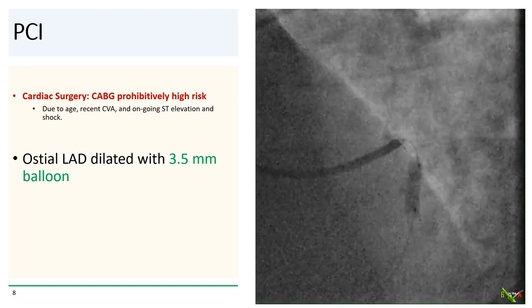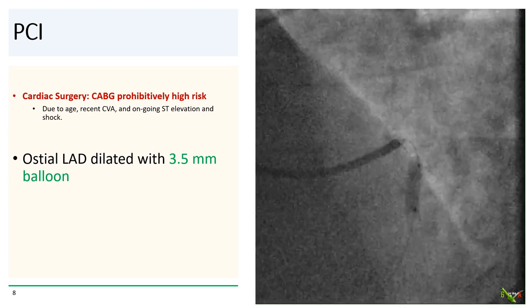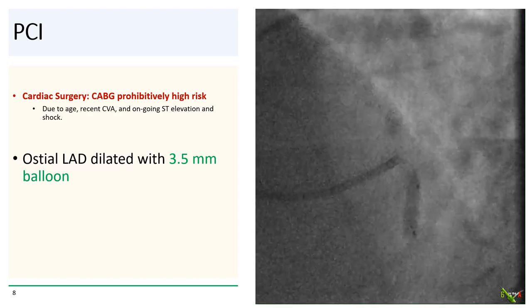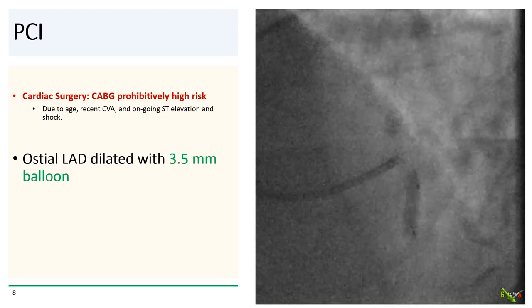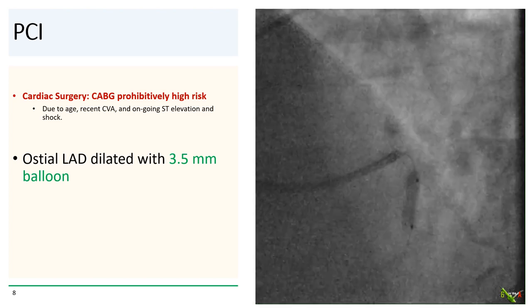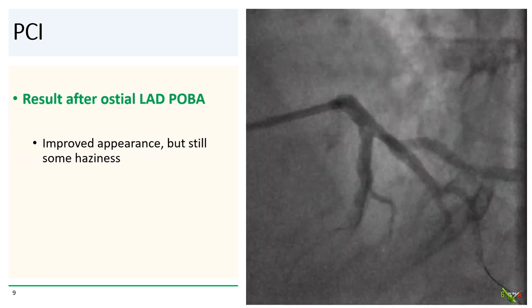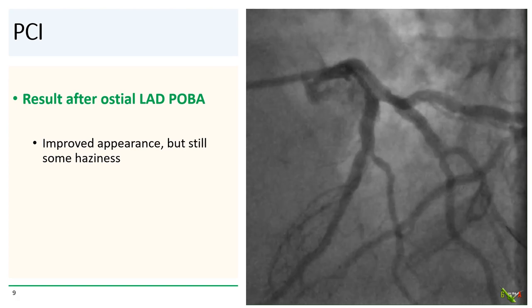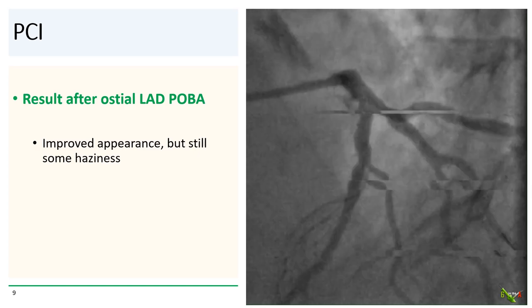We called our cardiac surgery colleagues, but they felt that CABG was too high risk due to his advanced age, his recent stroke, and ongoing ST elevation and shock. So we went ahead with a PCI strategy. We gently dilated the ostial LAD with a 3.5 millimeter balloon. After angioplasty, the LAD looked a little better, but there was still some haziness, probably reflecting the ruptured plaque.